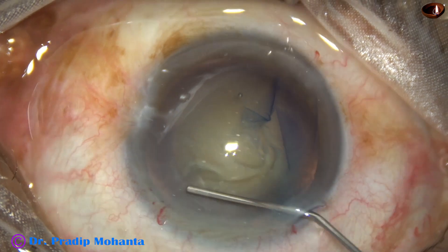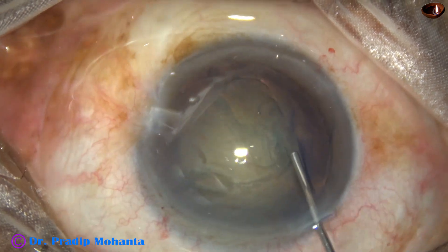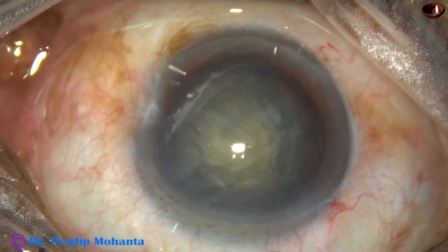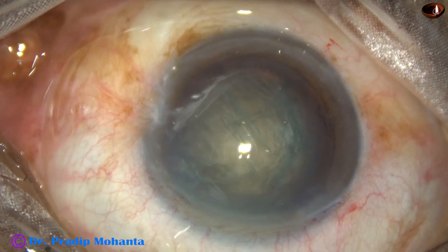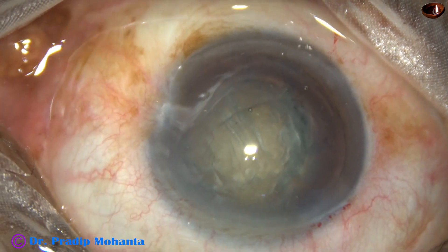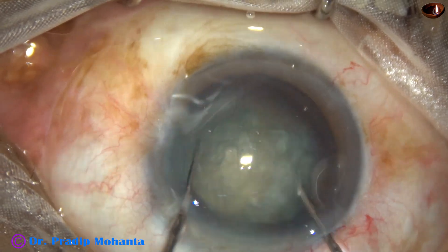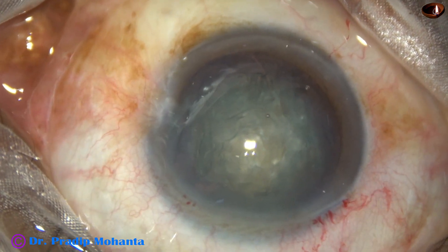Hydrodissection. BSS is injected just under the anterior capsular rim, and then the nucleus is tapped. The nucleus is mobile, but it did not rotate freely. Once I make out that the nucleus is free from its capsule, I can bimanually rotate it. Stress on the zonule becomes less if we rotate the nucleus bimanually.